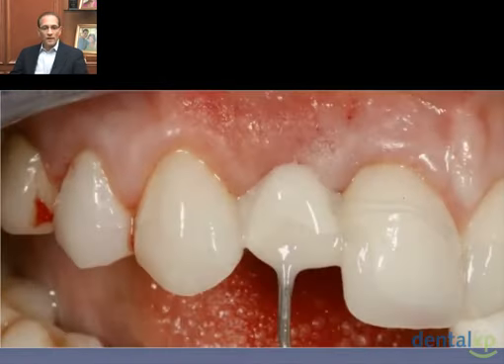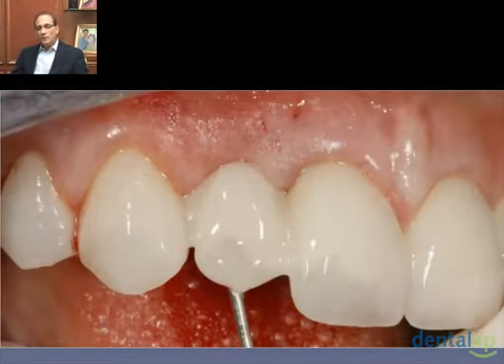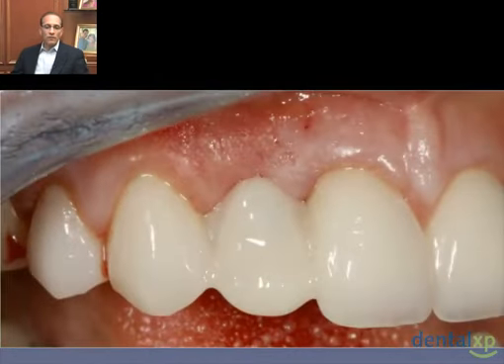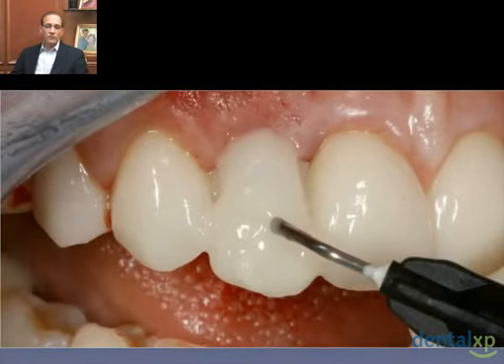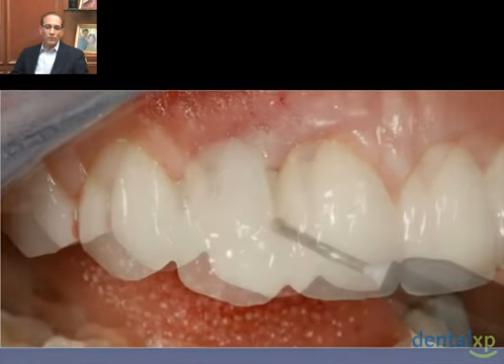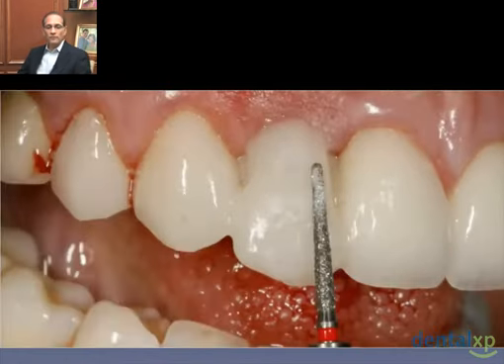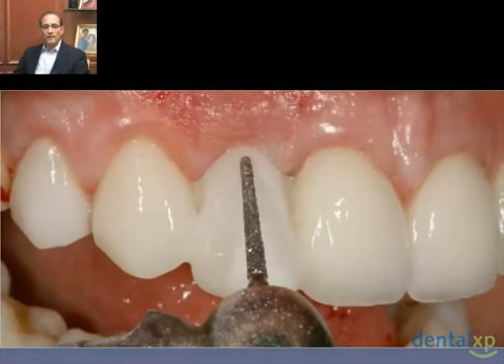I'm going to take my flow composite, and I'm going to begin to flow composite around the provisional abutment, and I'm going to flow it, creating contour as I go. Rather than make one large amorphous blob, I can sort of create the contours of a lateral incisor, and we continue to add to it until we finally get to a shape that we can start to contour and create a lateral incisor from. So we're going to take out our handpiece.